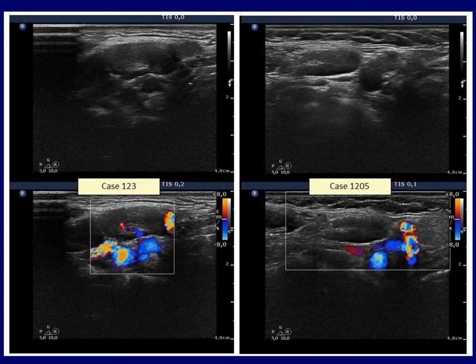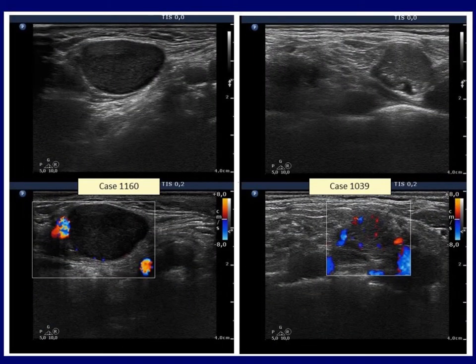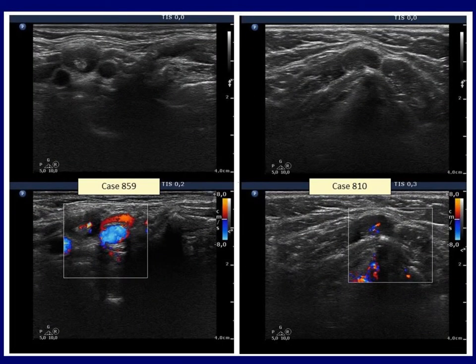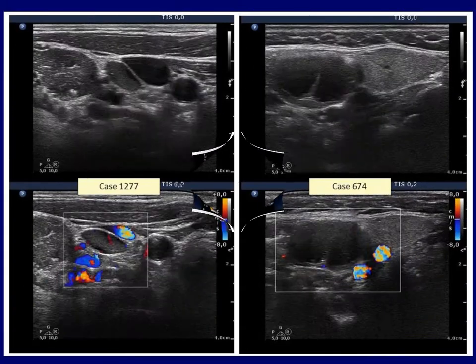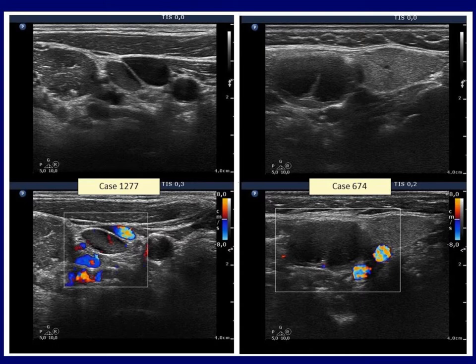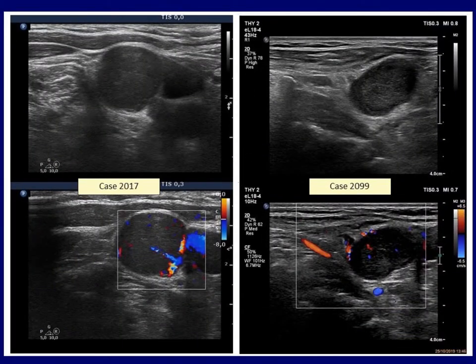The left node had a metastasis of colon cancer and was avascular, lacking regular hilar vascularity. In the right metastatic papillary cancer node, vascularization was irregularly and diffusely increased. One case had a hyperechoic mass within the node presenting vascularity; another metastasis of papillary cancer lacked hilar vascularity but showed abnormal vascular signal. The left metastasis lacked hilar vascularity and the presence of scanty flow had limited importance. The right node contained a metastasis of a basaloid cell cancer and was avascular. These nodes had metastases of thyroid cancer — the left case is clearly suspicious on the presence of irregular vascularity, and the right pattern with multiple vessels is also not reassuring.